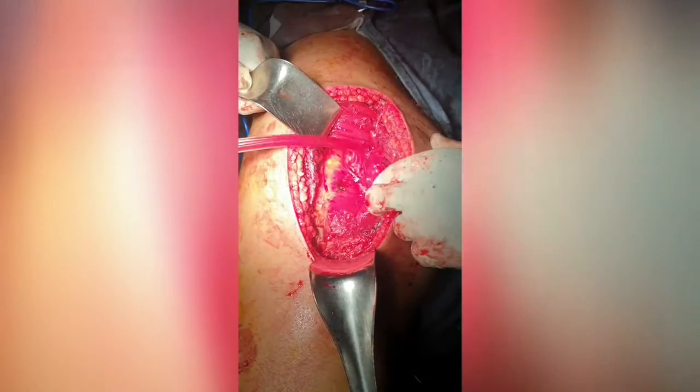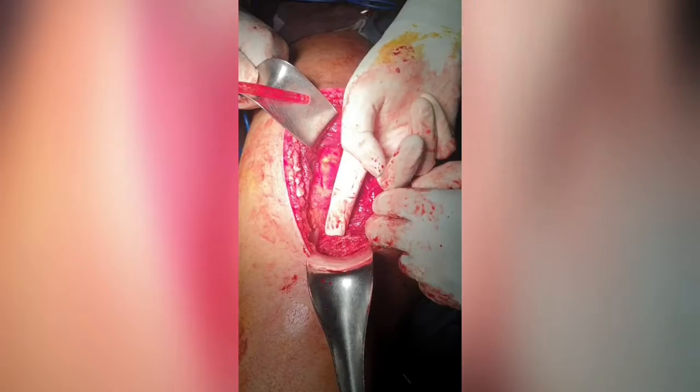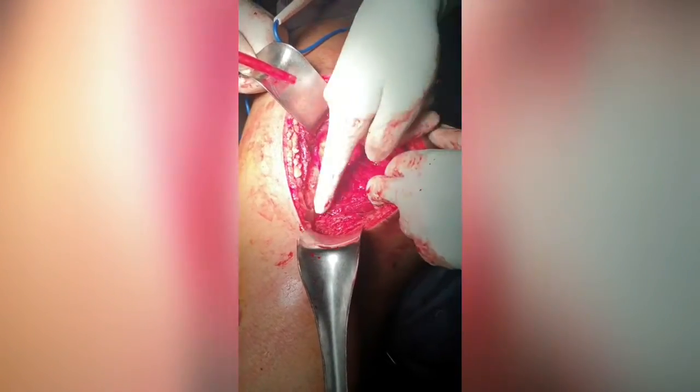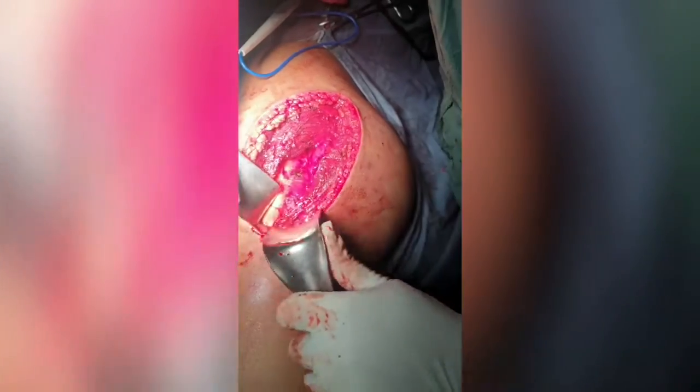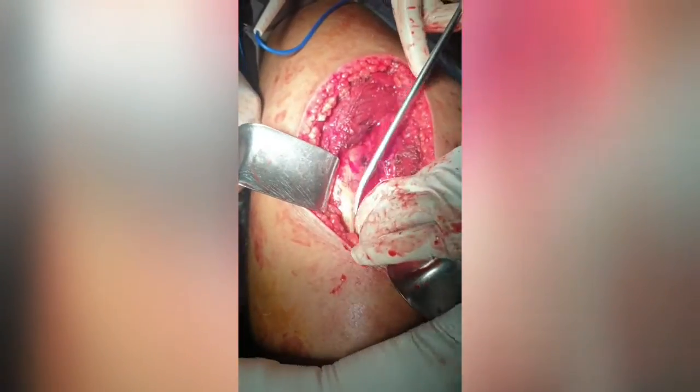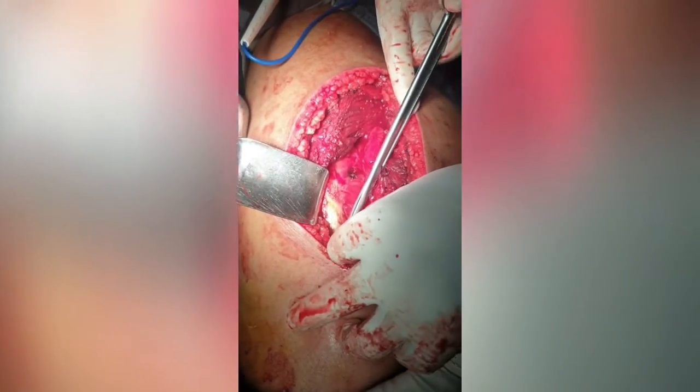Sometimes for better exposure you have to cut the insertion of the gluteus maximus about 1 centimeter from its insertion in the gluteal tuberosity, and we are now cutting the insertion of the gluteus maximus about 1 centimeter from its insertion for better visualization of the structures.